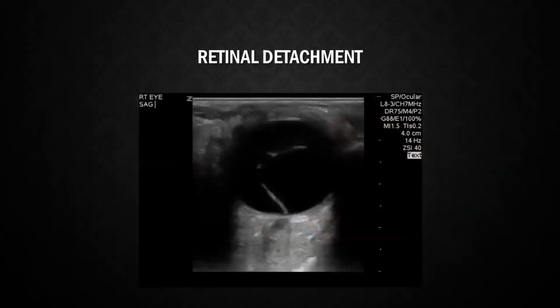So a retinal detachment, you're at risk for this with age, but also with trauma and a history of eye surgery. Patients typically present with painless vision loss. They may have floaters in their vision or see flashing lights. Sometimes they describe a curtain in their visual field or a shadow in the periphery. The membrane tends to be a bit thicker than the other detachments, and it might move some again with eye movements, but it's going to be less mobile than your vitreous.